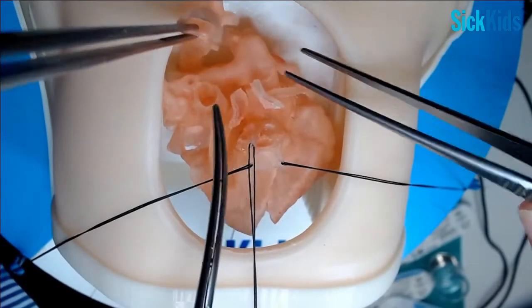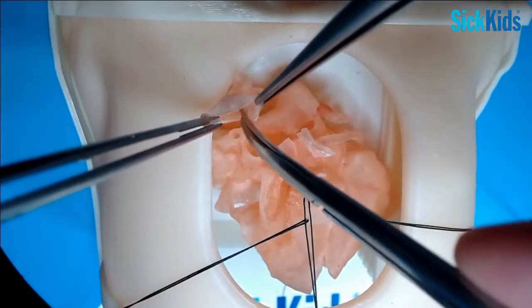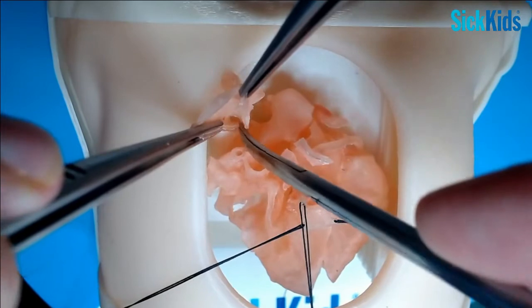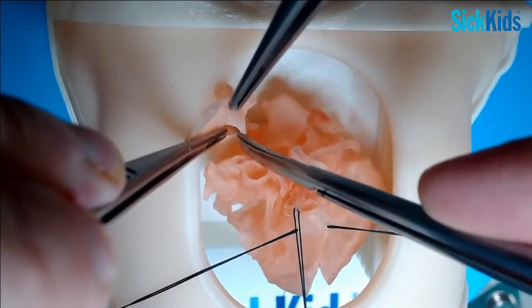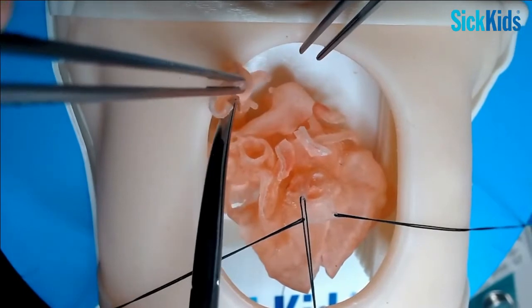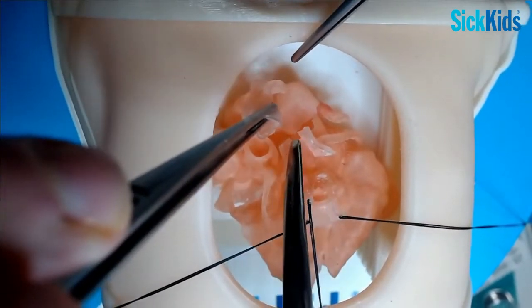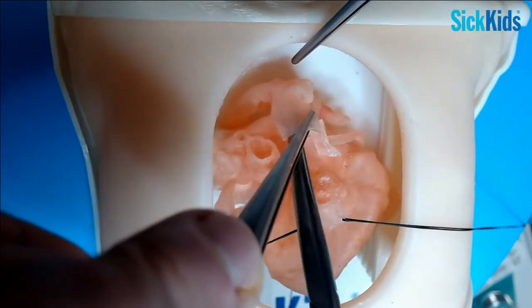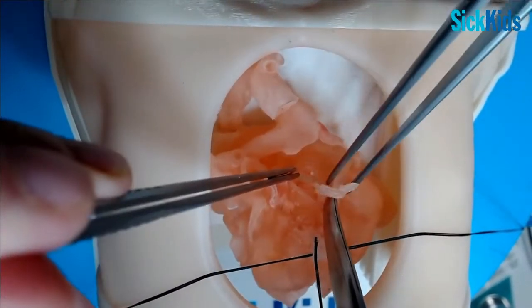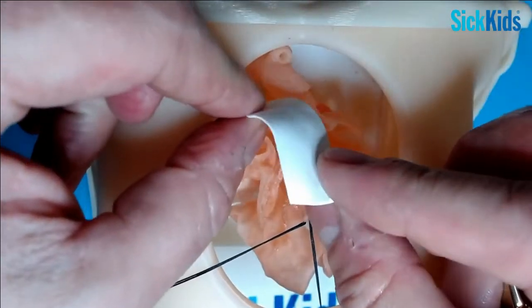I'll cut my little duct. Normally there might be a coarctation ridge to excise, but I open up the whole arch - right from where you've transected it, across the site of the coarctation. Resect the whole coarctation and join the back walls together. The patch can come all the way up to augment the aorta, all the way up here, so you get a match between this and what's going to be your neo-aorta much closer in size, instead of having a very small artery to match to a very big one.